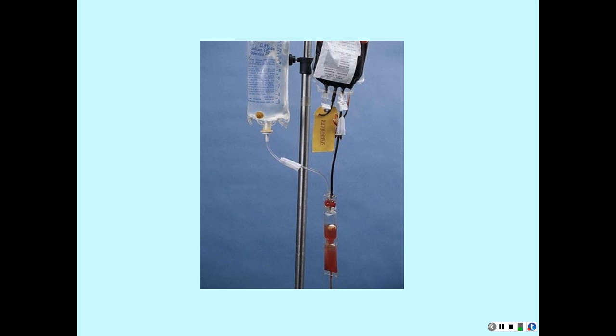You clamp the saline line, right? Yeah, because you'll shoot it back up in there. You will have peak saline. It's pretty, but you're wasting blood. You waste blood.